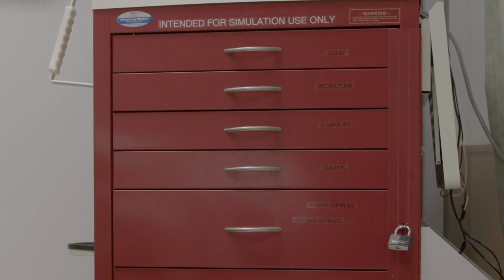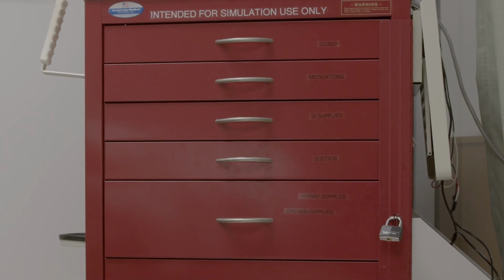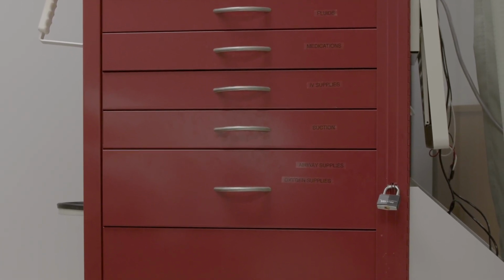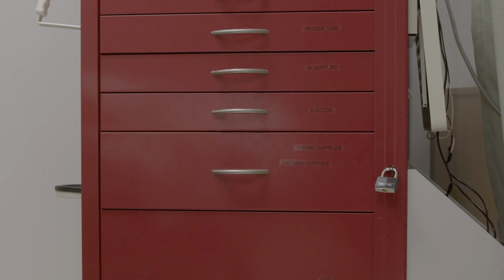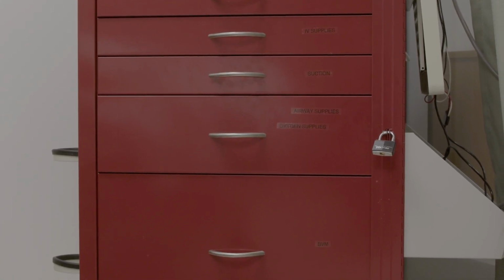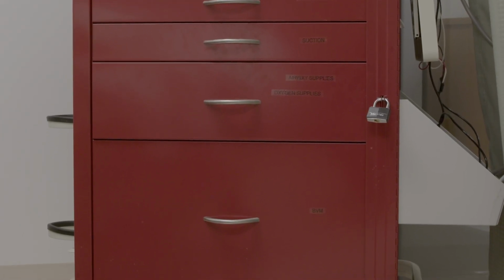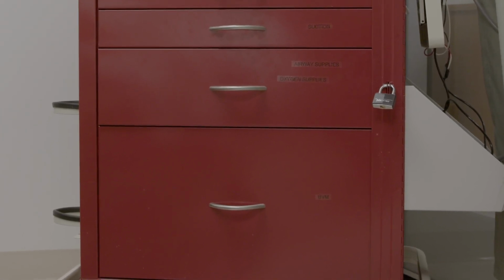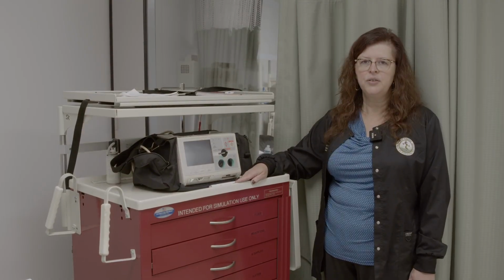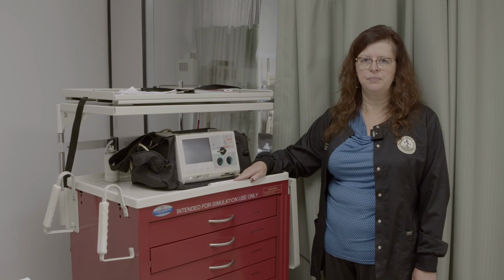The first drawer of the cart contains IV fluids. The second drawer contains medications. The third drawer contains IV and injection supplies. The fourth drawer contains suction supplies. The fifth drawer contains airway management supplies. And the sixth drawer contains a bag valve mask as well as a Foley catheter kit. All the drawers are clearly labeled for your scenario.